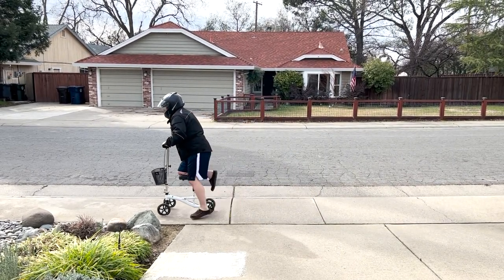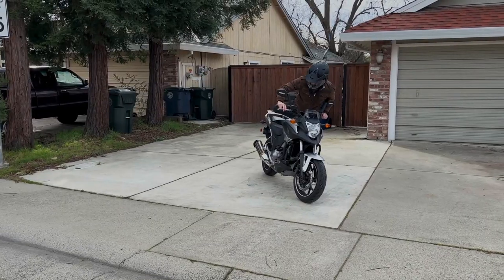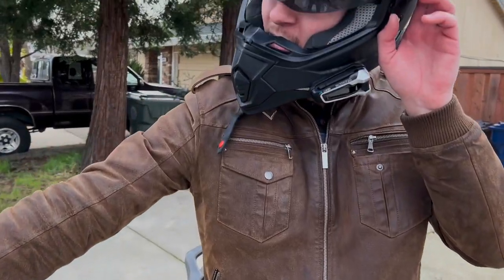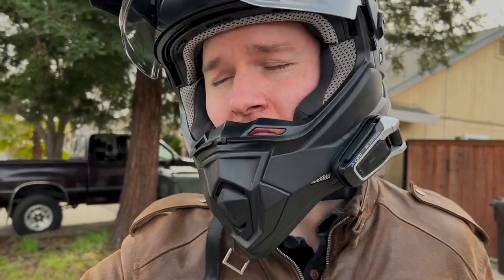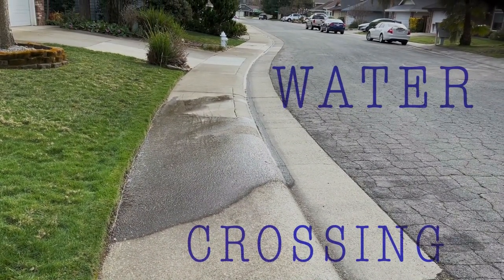It may not be the speed you're used to, but when other riders see you they know — hey, it takes more than road rash to keep this guy down. Respect. As any adventure rider will tell you, one of the most difficult obstacles to overcome is the water crossing.